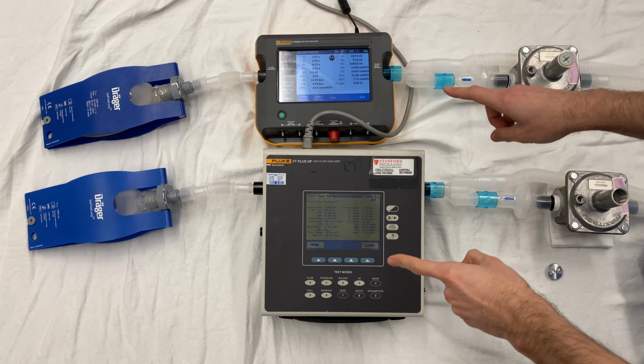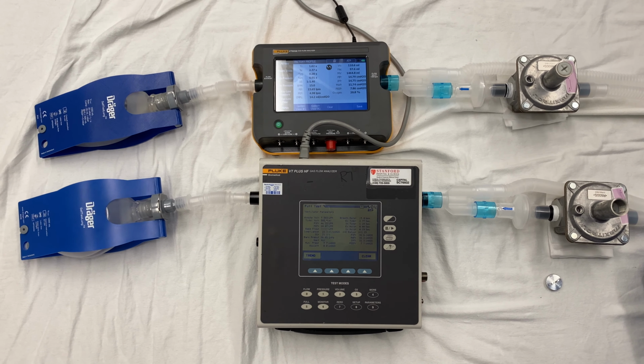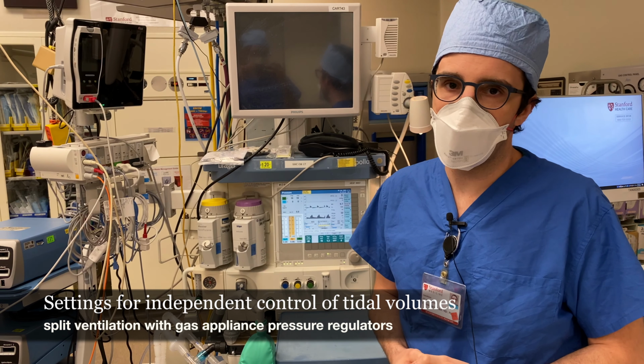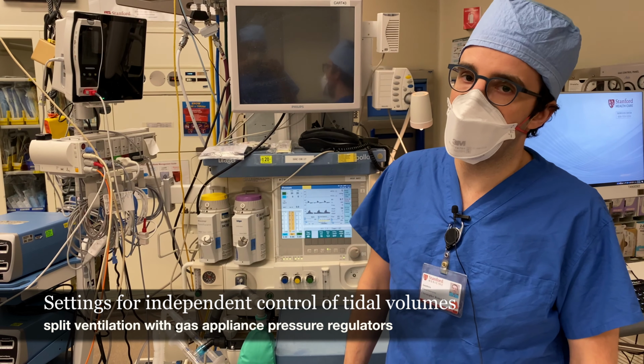You need this information to be able to make adjustments to the pressure regulator to make sure that you're delivering what each patient needs. So now I'm going to take you through just a quick demonstration of how you can use these pressure regulators to independently control some of the ventilatory parameters for each of the patients in this simulation.